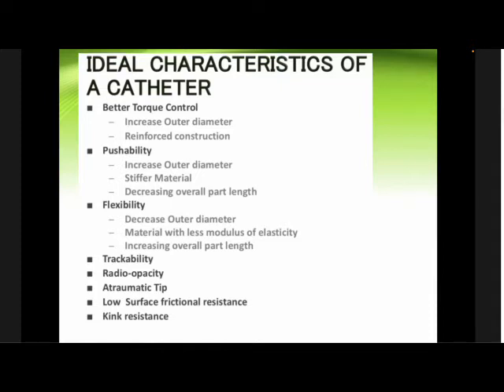Whereas flexibility is decreased by the outer diameter. Lower modulus elastic substances increase the flexibility. Flexibility is also increased by increasing the overall length of the catheter.